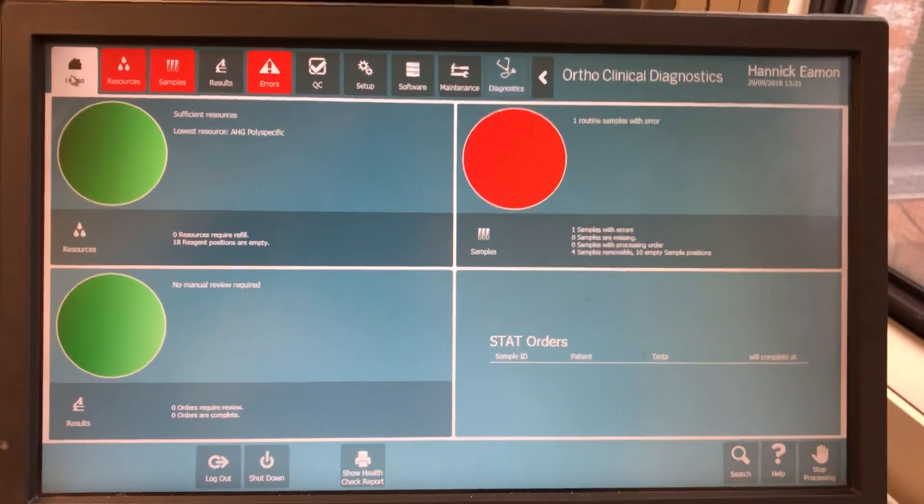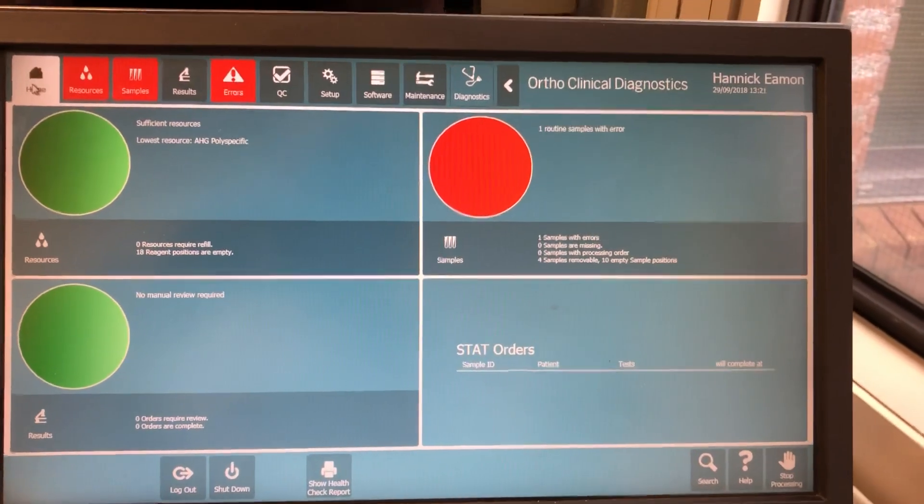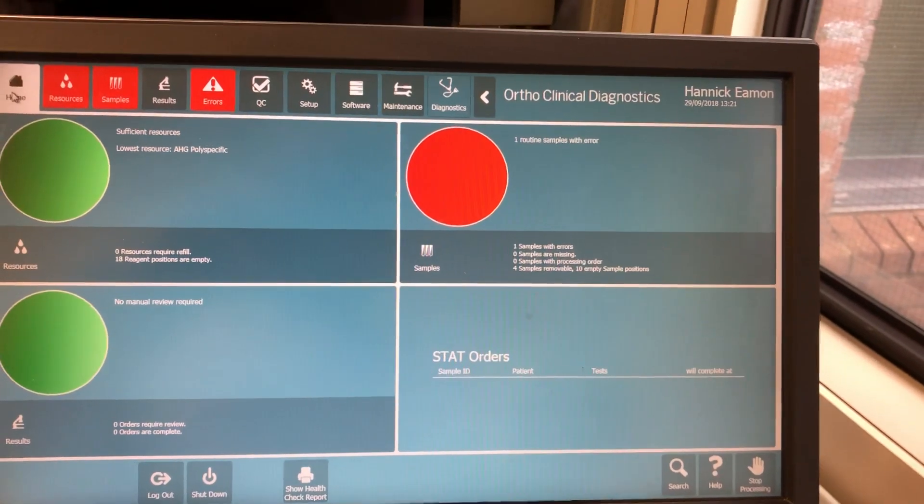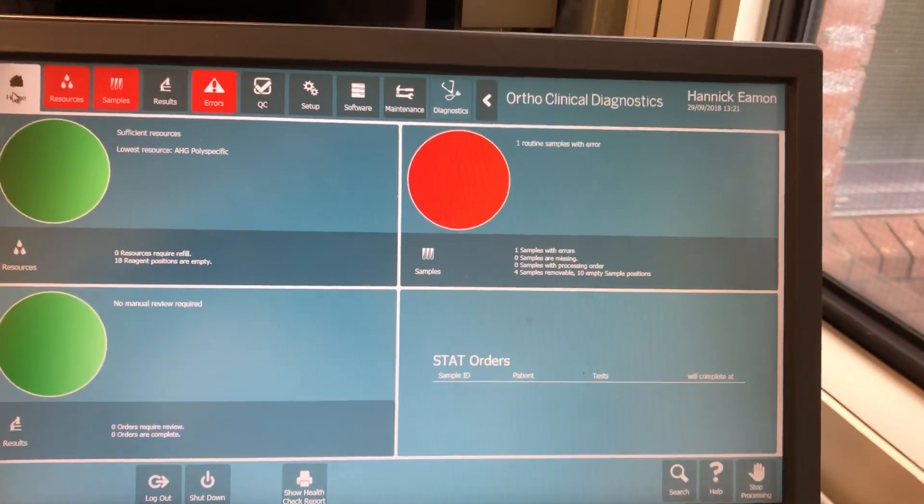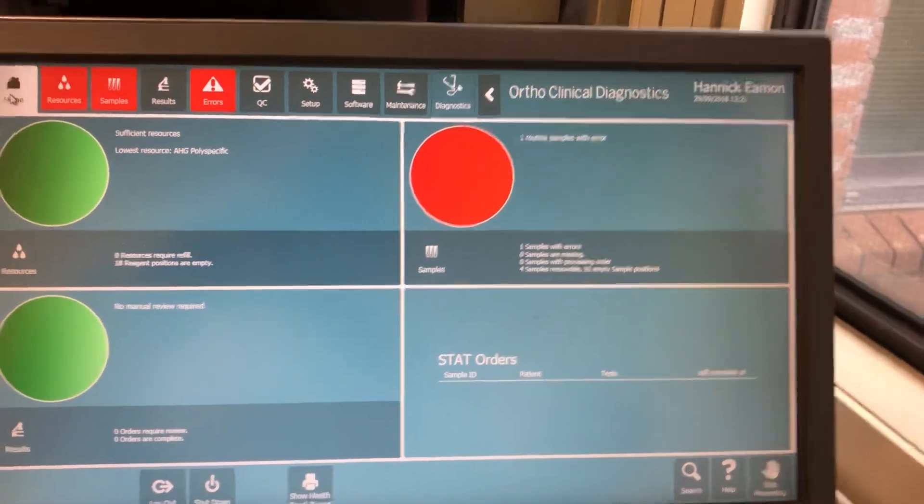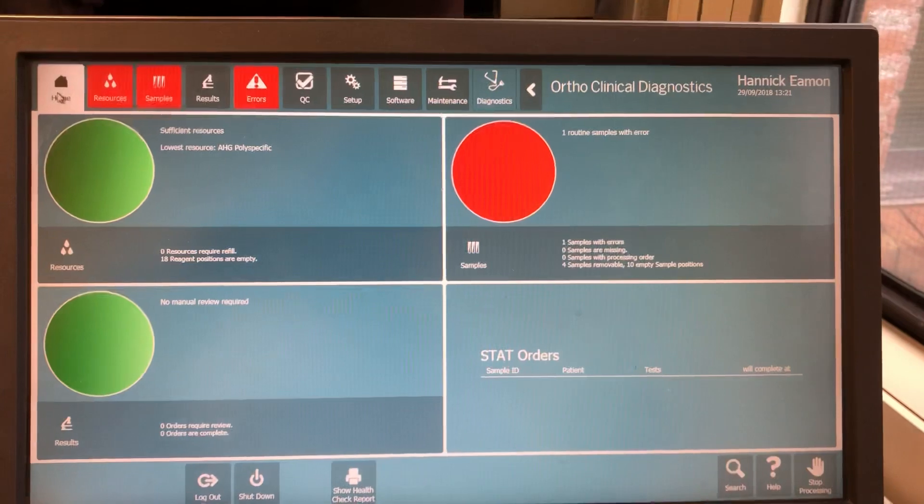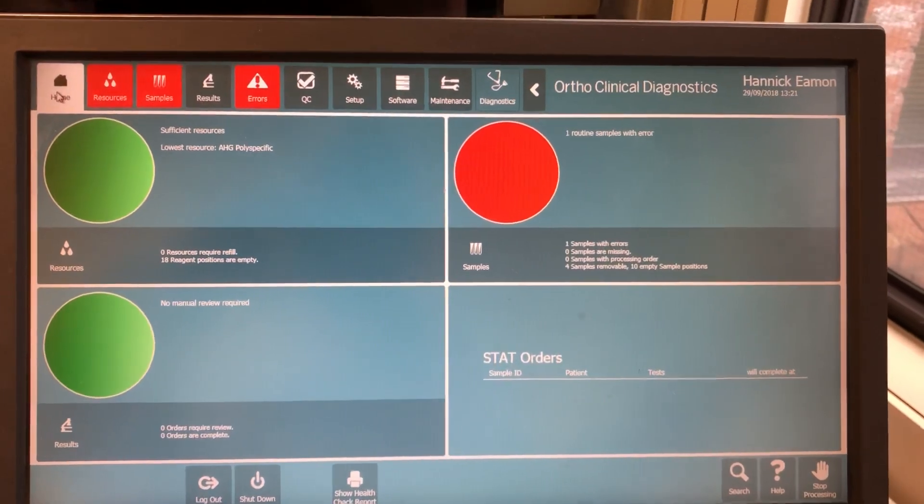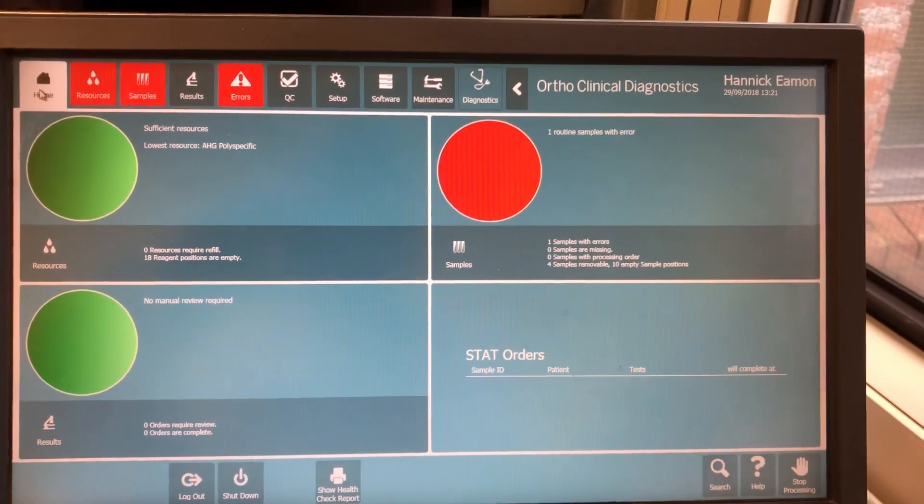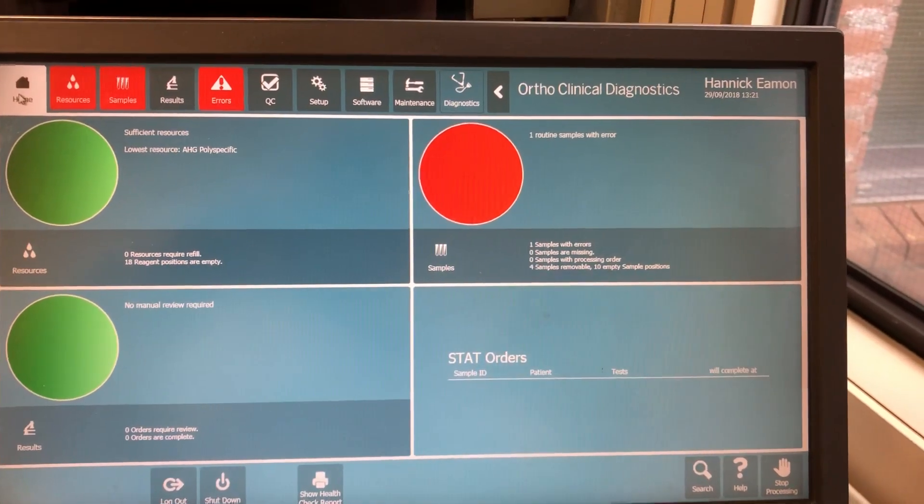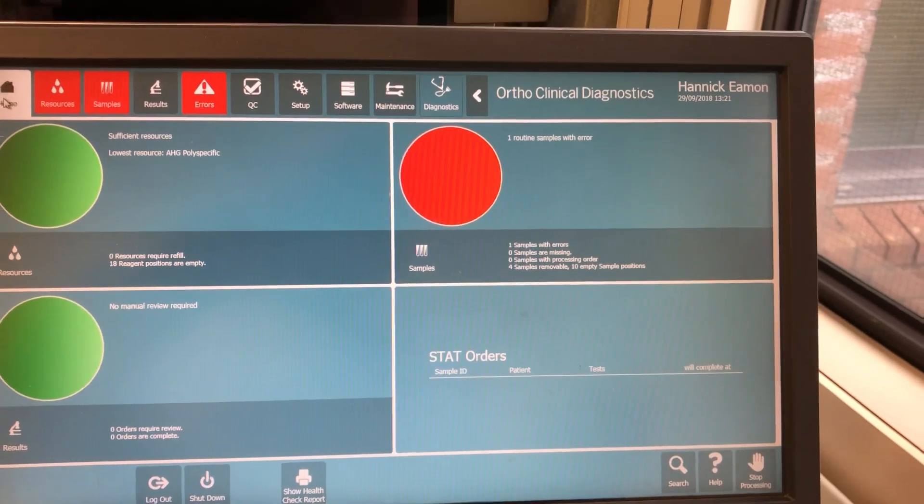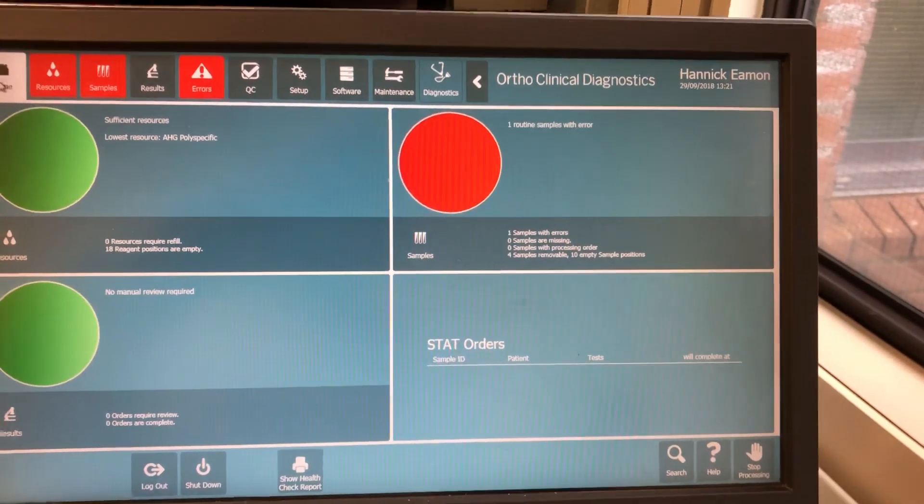The first one is that the interface may not be running. Second reason is your network might be down so the comms between our laboratory information system and the vision isn't operational. And the other reason may be that the test has been aborted.